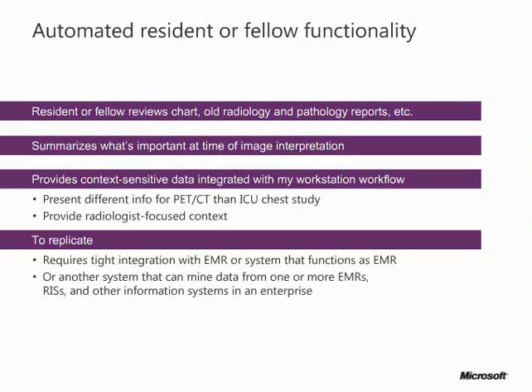It would be really nice to have that at the time I'm doing image interpretation. Were there previous recommendations that were made? What are the results of pathology studies? Is this a follow-up examination? Were previous studies normal? And be able to have all that synthesized for me to be able to see and understand in just a few seconds.